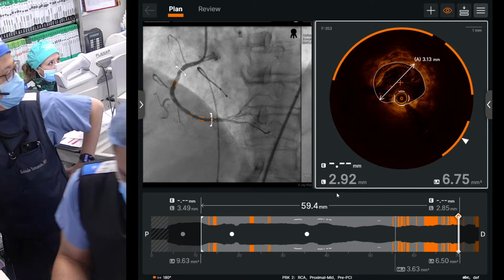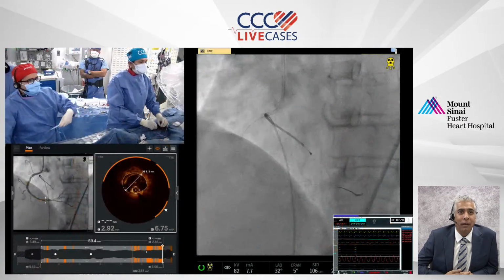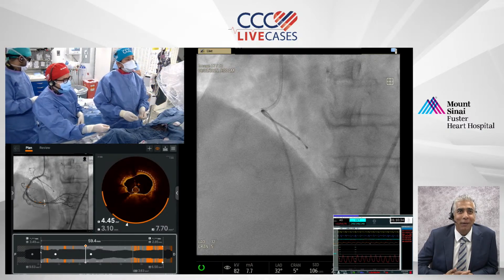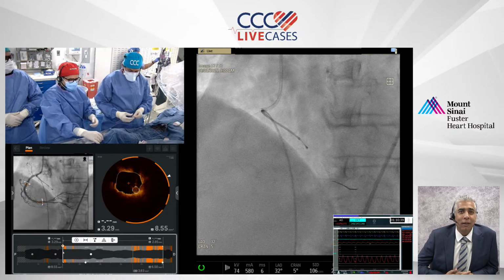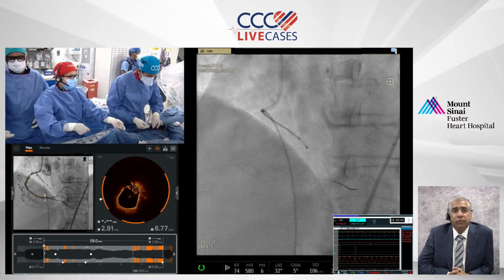Yeah. I think another quick point is that with overlapping stents it's important to consider where you'll overlap and any side branches. So I like that 48. I think 38 might land, and I might have done 38-28 originally to save a couple hundred dollars, with the 48 being more expensive, but I think that would land right by that branch.